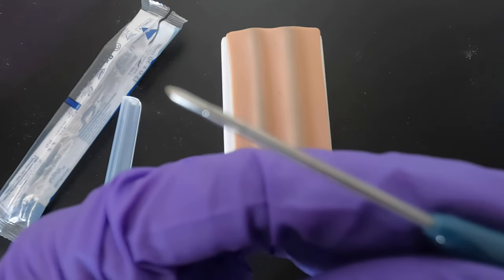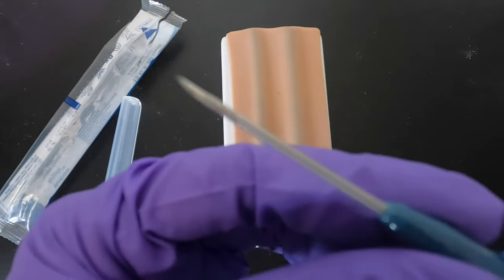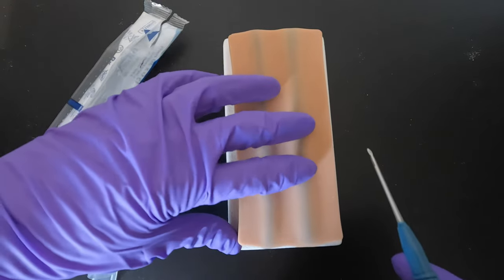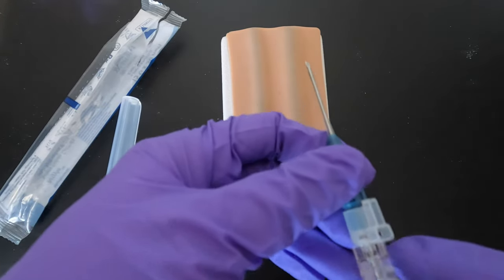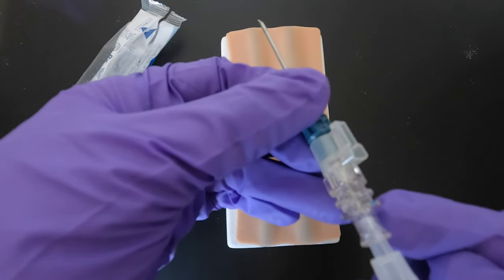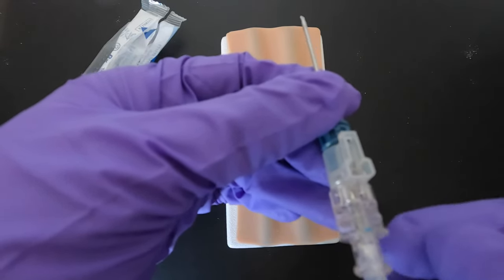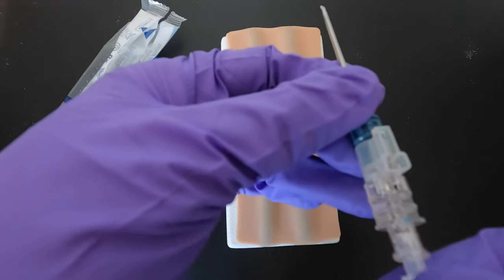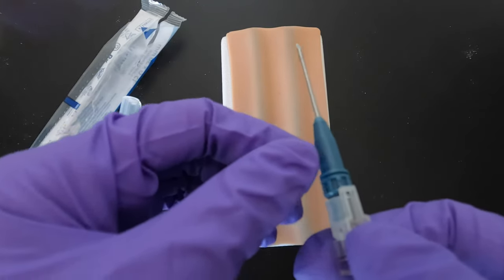This will be your needle. Keep it bevel up — you can rotate this one to find your bevel orientation. Make sure it's bevel up, then find your vein. The good thing about this needle is that when you hit the vein, there will be a flashback of blood, so you know you're inside the vein. Then just advance maybe a quarter or half an inch.